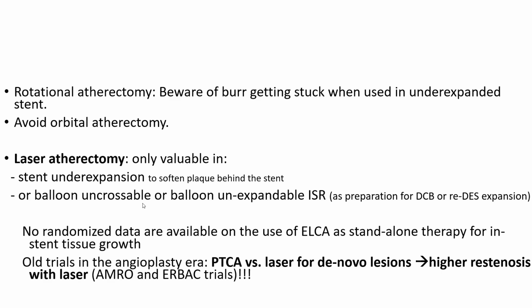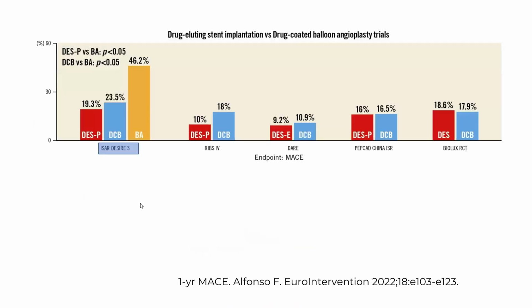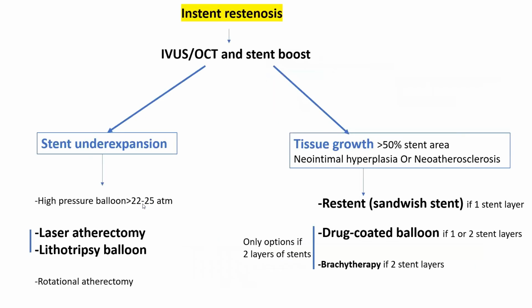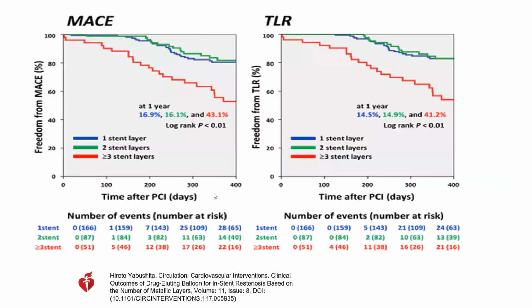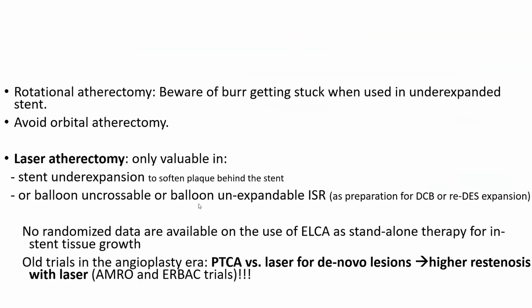Laser atherectomy has no value, I will repeat, no value for isolated in-stent tissue growth. It has no value for that. It has value for this or the combination of the 2, but no value for isolated tissue growth. I know a lot of doctors who use it, but I see no data for it.